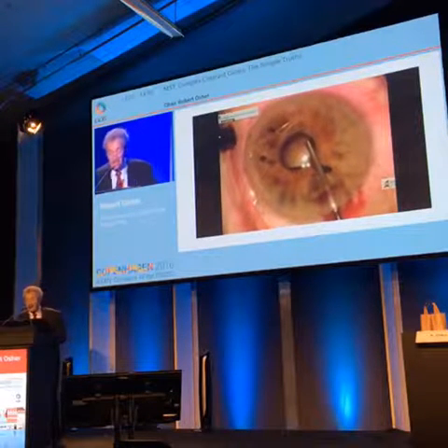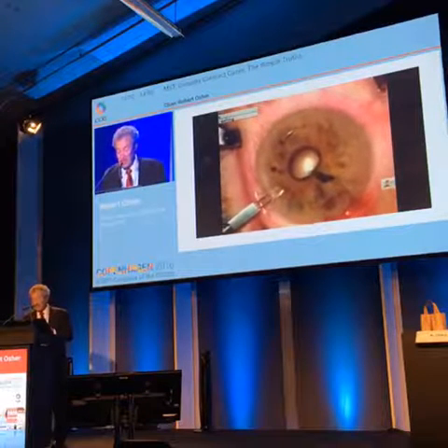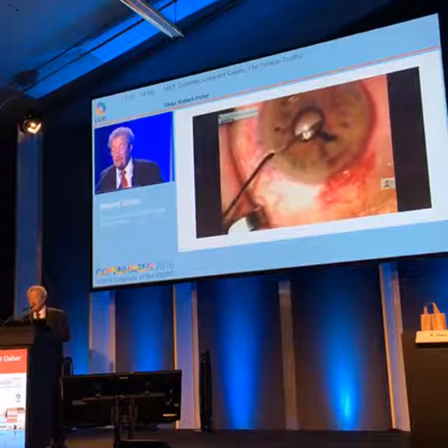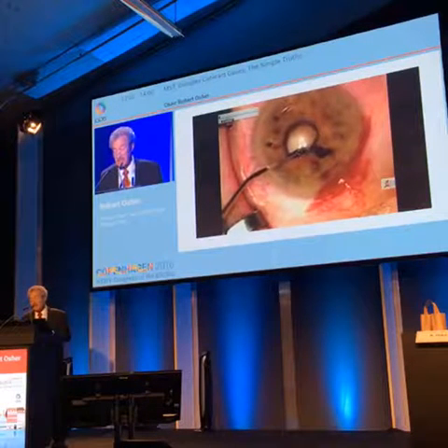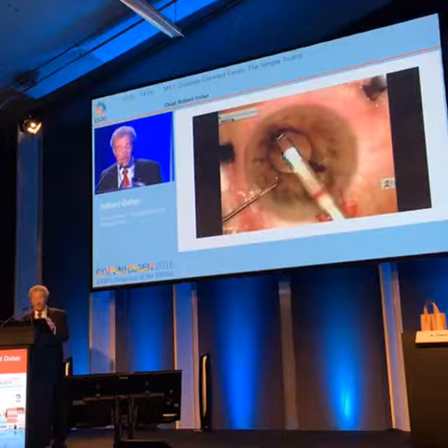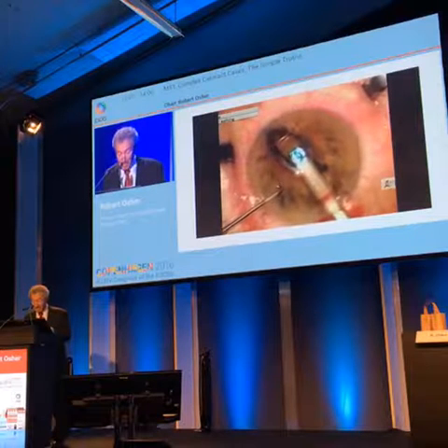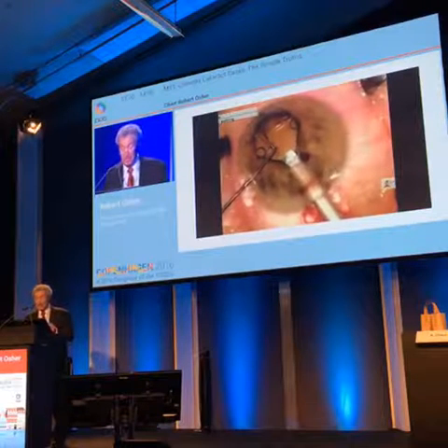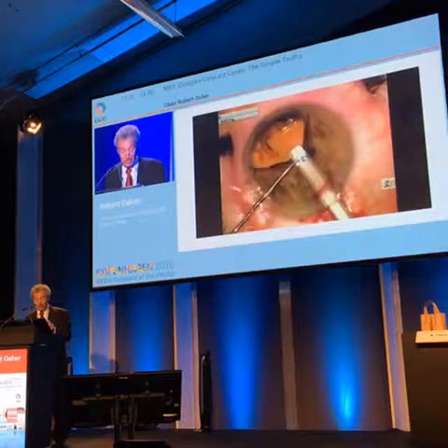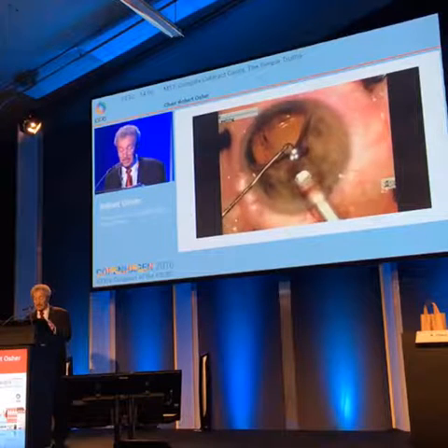Notice that there's a nevus there. I forgot there was a nevus there, as you'll see later in the operation. I raise the iris off the anterior capsule. This patient has also had a peripheral iridectomy, which you can see up by my instrument, for the angle closure. These are very difficult cases.